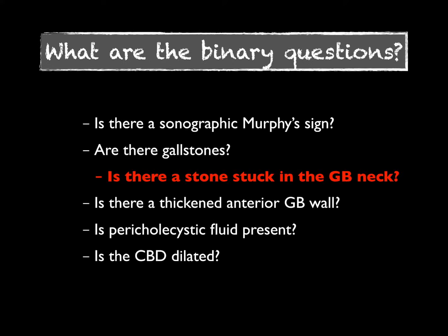As always, I like to talk about the binary questions, and these are the yes/no questions that we like to define. And some of these do require measurements, and these, in conjunction with the clinical picture, can help us determine if a patient has cholecystitis or make that diagnosis.